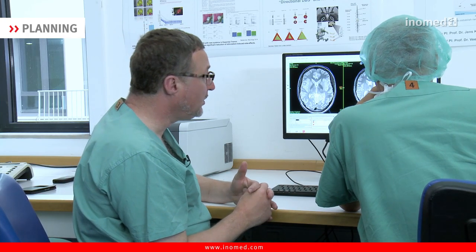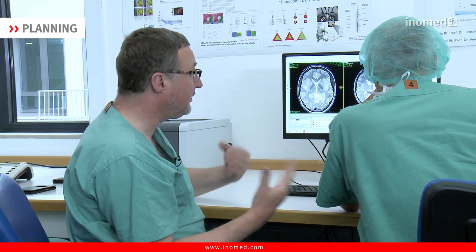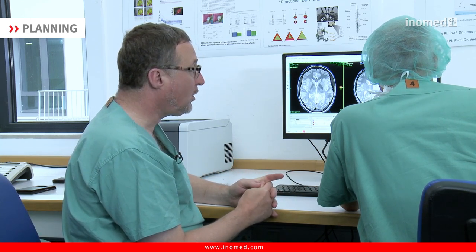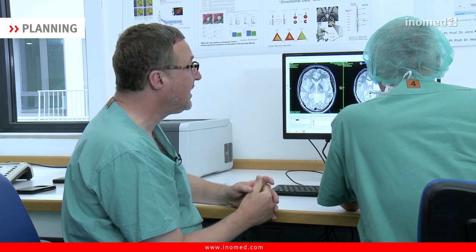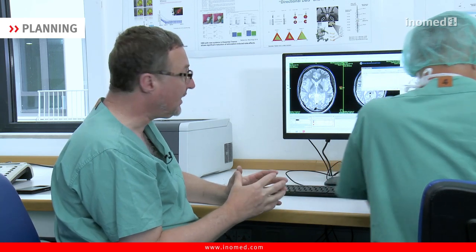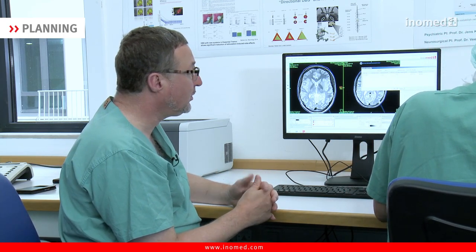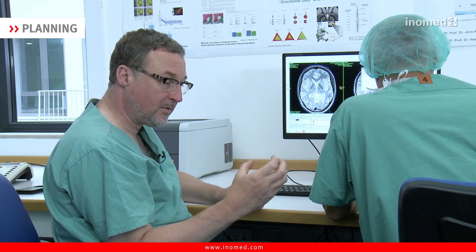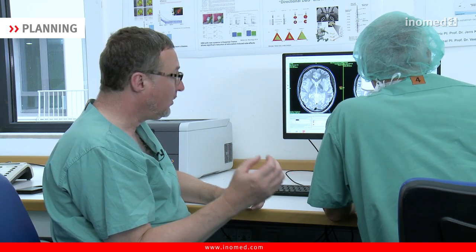We are now going through the entire irradiation parameters of the preliminary planning once again. Checks and cross-checks are planned again and again to avoid mistakes. In this case it is a low-grade glioma. We follow a certain scheme which implies that we intend to implant a 65-gray surface dose — meaning 65 gray on the surface of the tumor, which is permanently left in situ until the seeds have decayed, in order to treat the tumor in a super- or hyperfractionated manner.